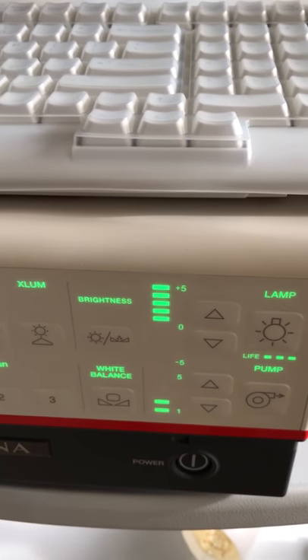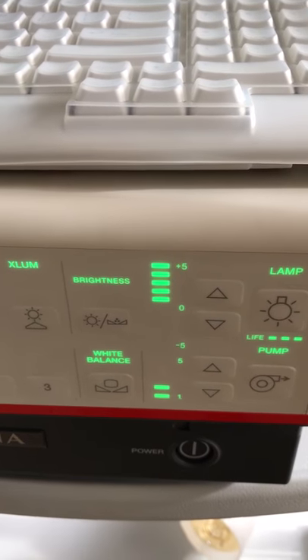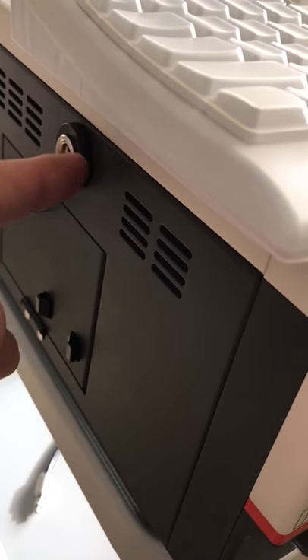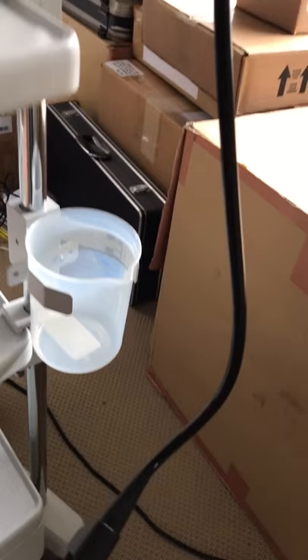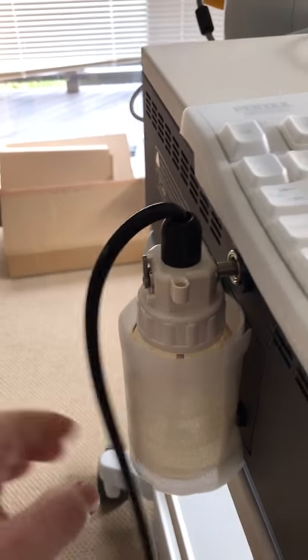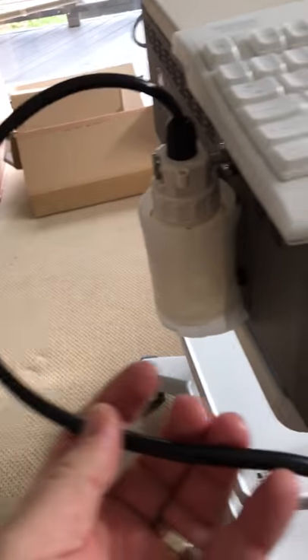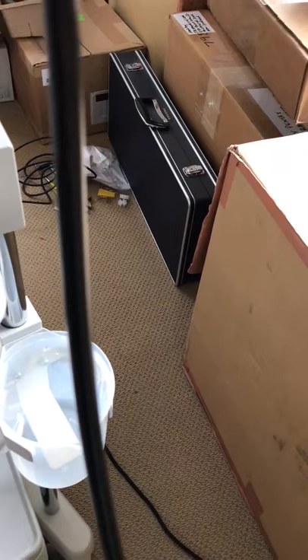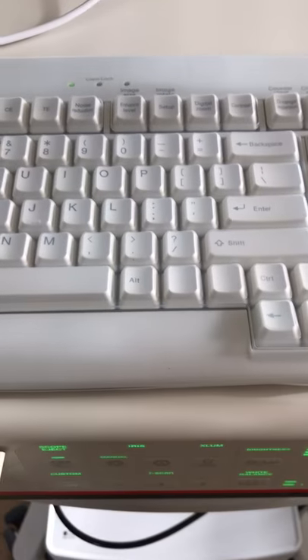We also have a pump here — you can hear that little noise. The pump is for TNE, transnasal esophageal procedures, which is relevant for ENT. On the side here is where we place the water bottle. We simply plug it into the TNE scope connection to supply water.